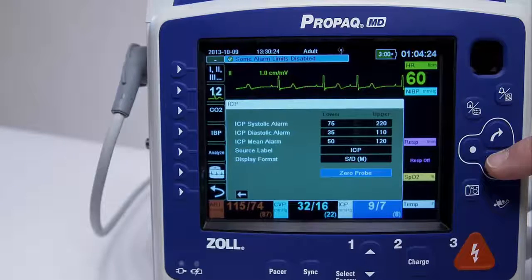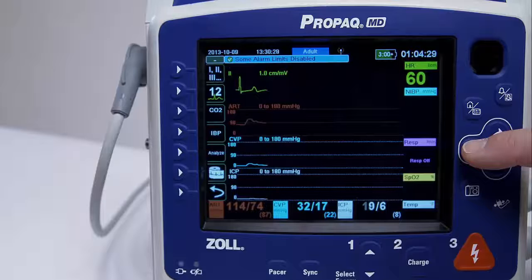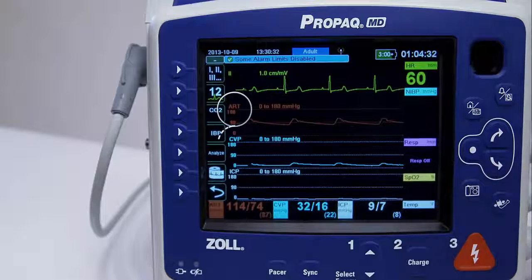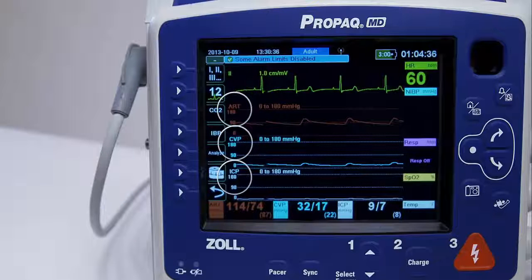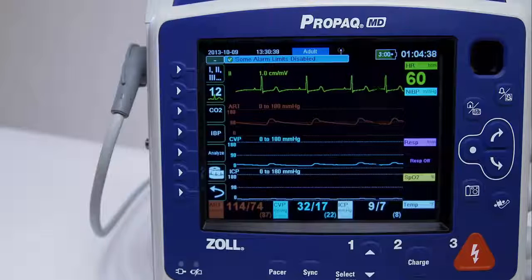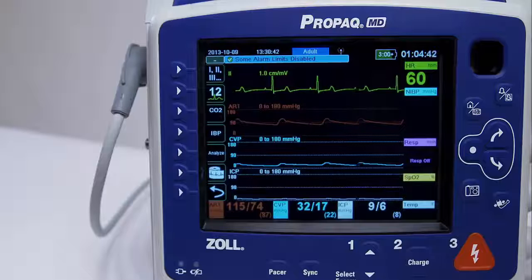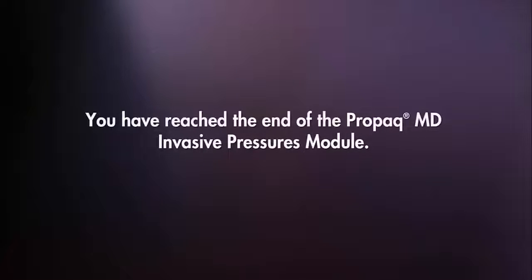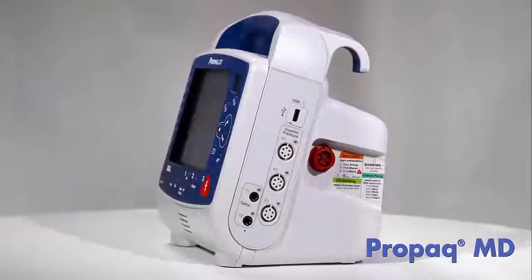In the IBP channel menu, you can select a label that identifies the source of the channel's IBP measurement. By default, the channels are labeled P1, P2, and P3. In this example, source labels are specified for all three IBP channels. The pressures can be measured in millimeters of mercury or kilopascals. You have reached the end of the ProPakMD invasive pressures module. For additional information on the other ProPakMD features, please review the corresponding module for those details.